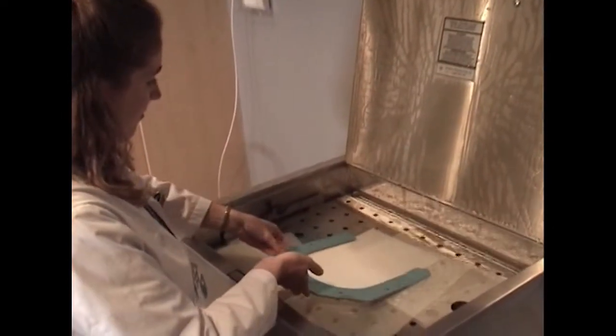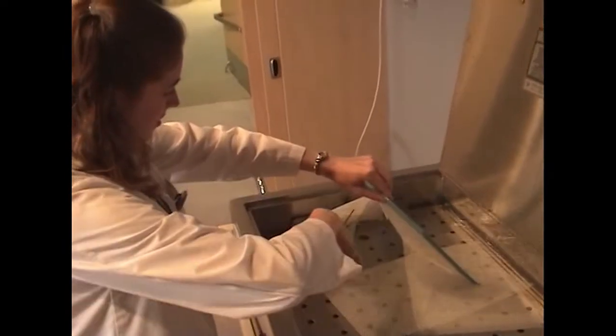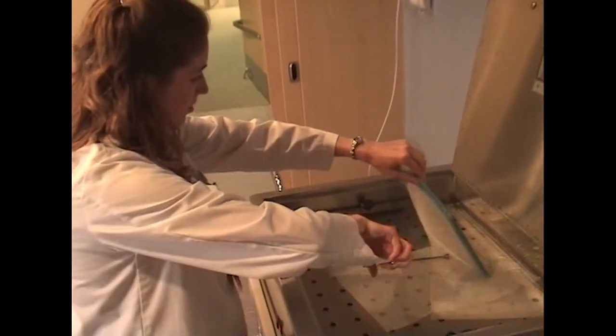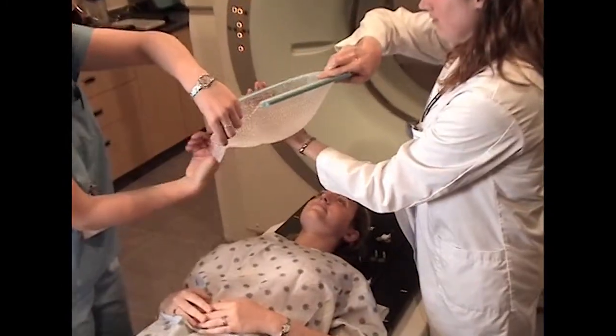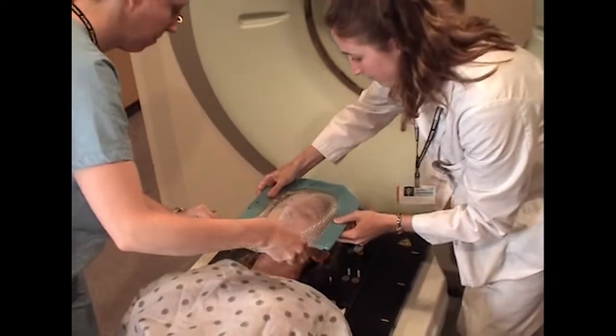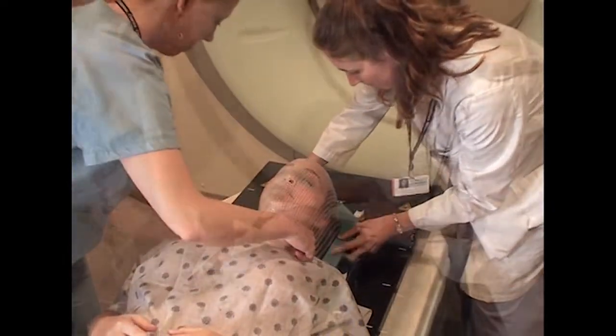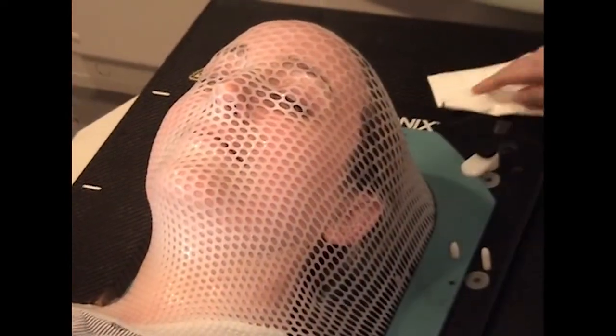If treatment is to be given to the head area, a personalized mask is created. This thermoplastic mask is placed in warm water to make it flexible. It is then formed over your face. The mask is an open mesh and you can breathe normally when it is in place. It allows us to precisely reproduce the position of your head for treatment on a daily basis.